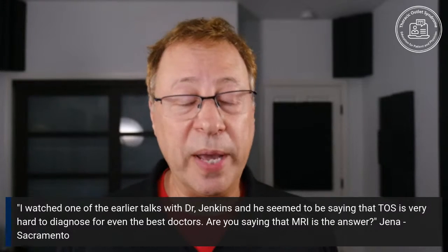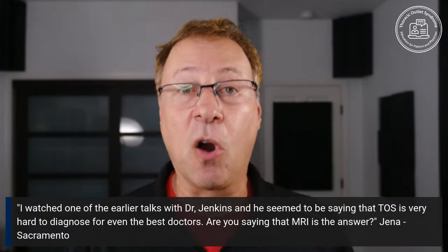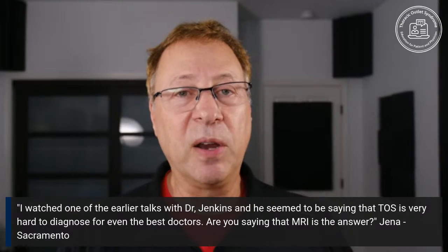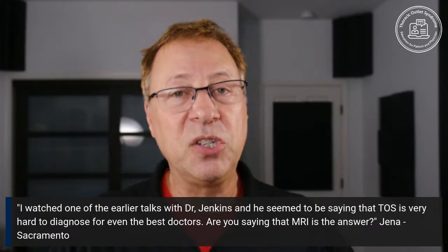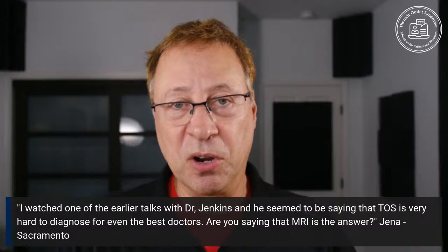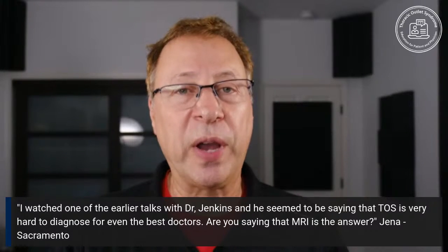But what we do know is there are nerve entrapments throughout the body, like carpal tunnel syndrome and cubital tunnel syndrome and tarsal tunnel syndrome. There's all kinds of these. And they're almost always diagnosed because a doc suspects the problem, sends the patient for an MRI, and the MRI shows the nerves that are involved and anything around the nerves that could be compressing or stretching or squeezing or affecting those nerves.